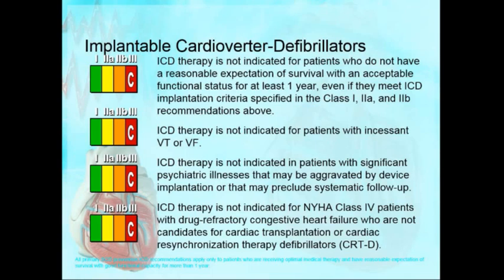What is the difference between CRTD and CRTP? It's pacemaker versus defibrillator. Cardiac resynchronization therapy with defibrillator means it does the pacing and can also shock you. CRTP is just a pacemaker, there is no shocking component. So when I say BIV, 95% of BIVs are actually BIV ICDs. There are very few patients who have BIV pacemakers. That's the difference between CRTD and CRTP.